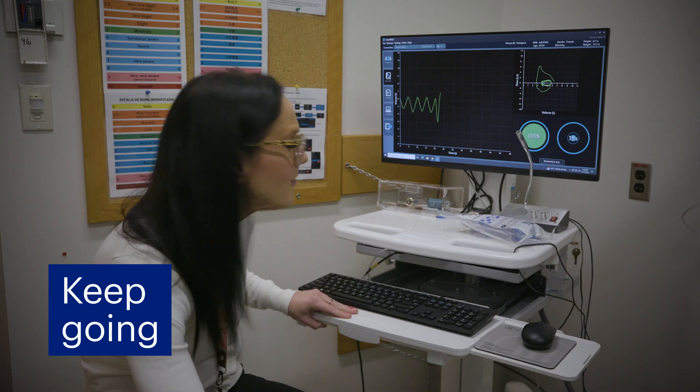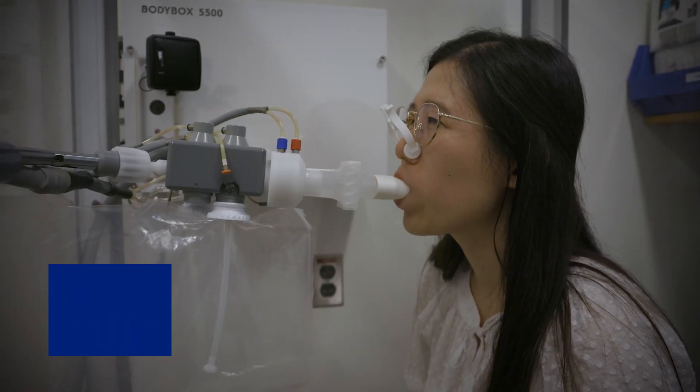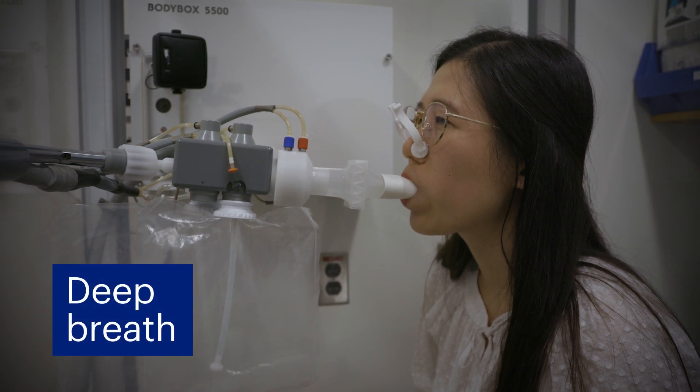You will need to continue breathing out until you're asked to stop, even if it feels like you have no more air left, until you're asked to stop and take a deep breath in.